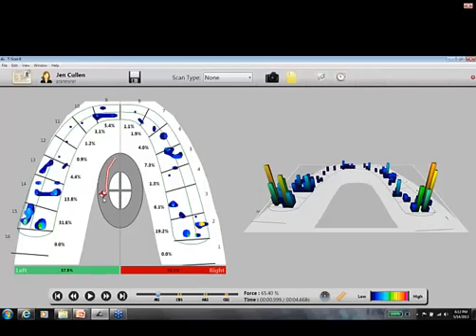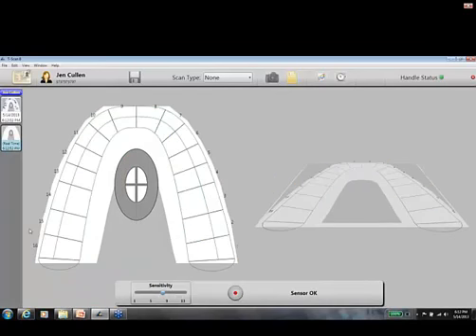And my pressure is more off to the left. And we want this to be right down the middle zone. And so that would be an area that we would look at right away. So let me take a new scan, and I'm going to slide to the left now.